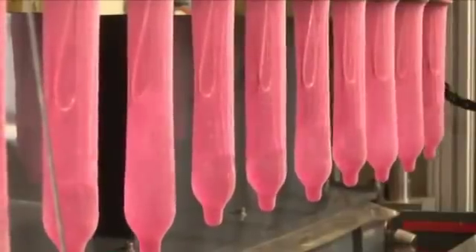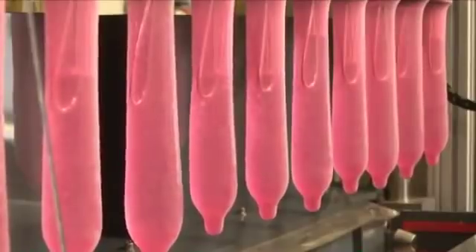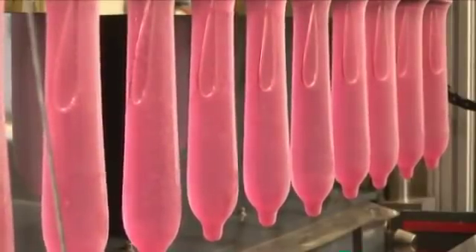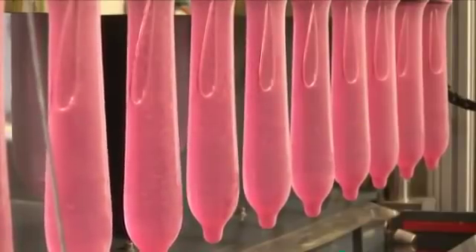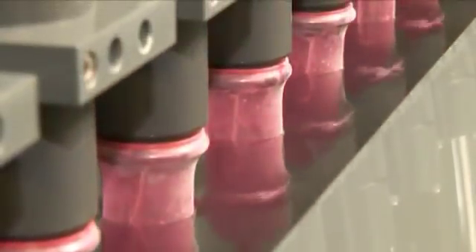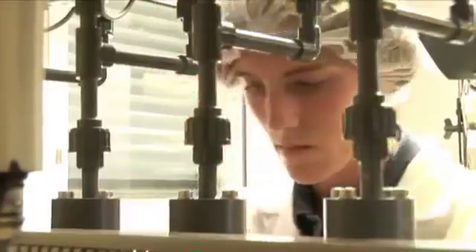Finally, another pinhole test completes this series of tests. This time the condoms are placed over an electric conductor and filled with water. Then they are immersed into a water-based solution to check whether any condom tested has a pinhole. If the electric circuit between the conductors in the condoms and the voltage source in the basin closes, one of the condoms has a pinhole. Such microholes are not visible to the naked eye.